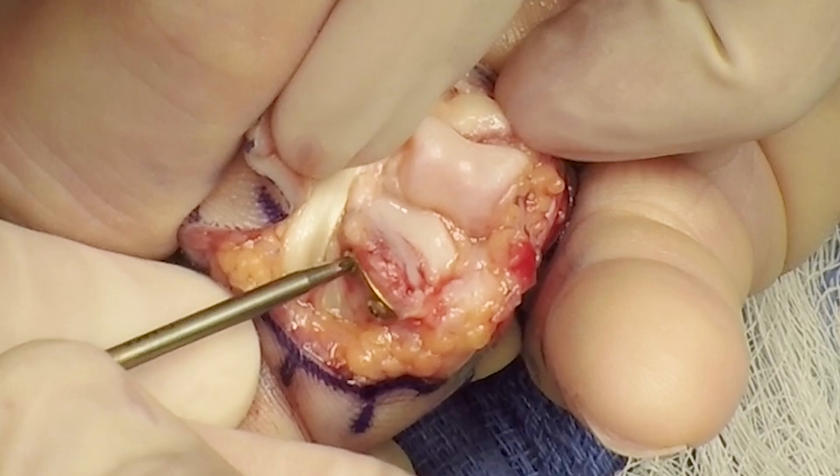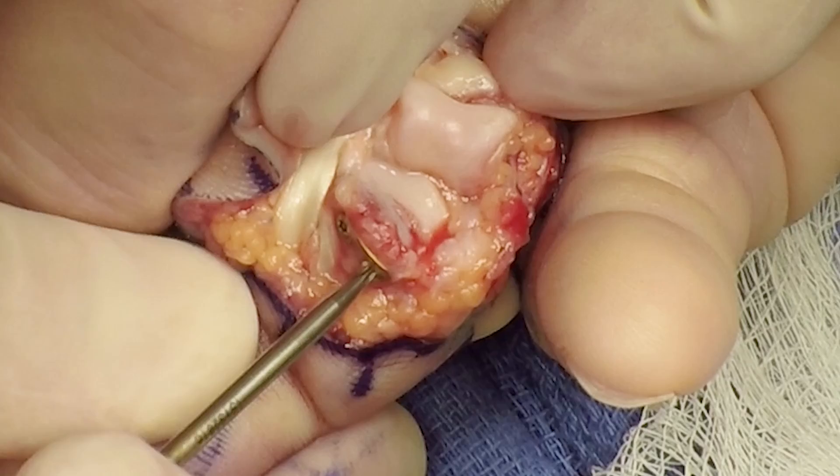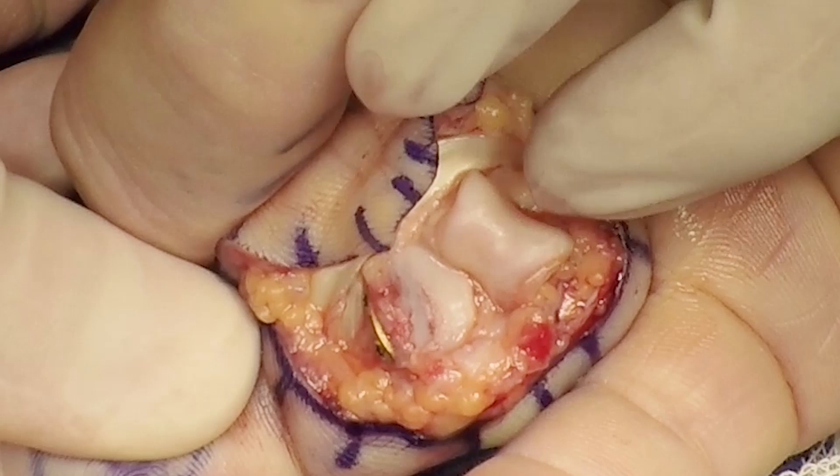Care is taken not to over-tighten the screws, which can narrow the joint. Anatomic reduction of the fracture is achieved.